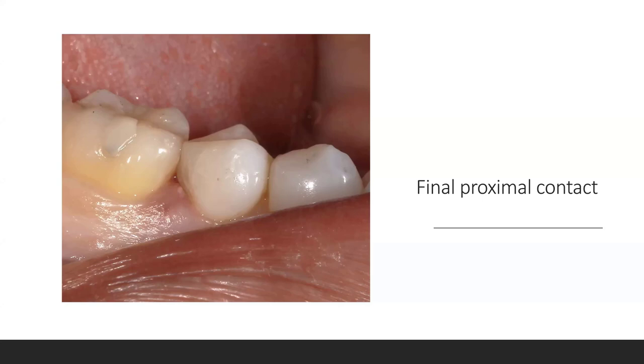Looking from the occlusal, here's your rebuilt bicuspid. She's 35 years old. Is the tooth half full or half empty? Would you want your tooth restored like this — rebuilt to minimize fractures and minimize shrinkage stress? How long can you now preserve this tooth? She's got to brush and floss, but this is how I keep teeth till their 75th birthday. You don't have to all agree with me, but I like to be thought-provoking in how I take care of patients.